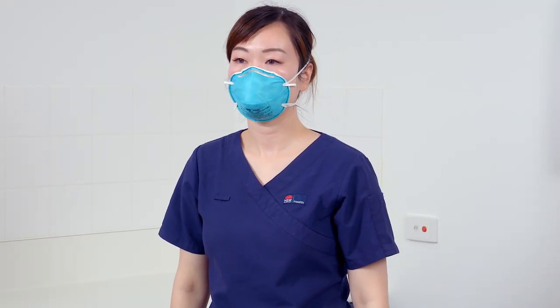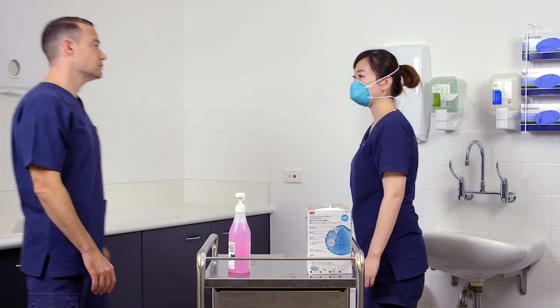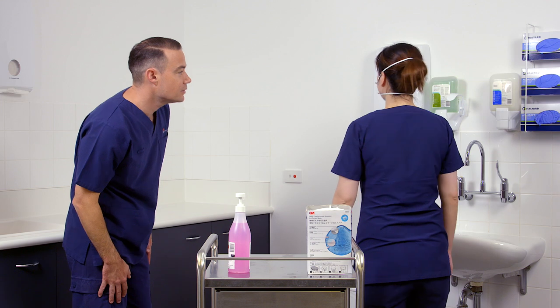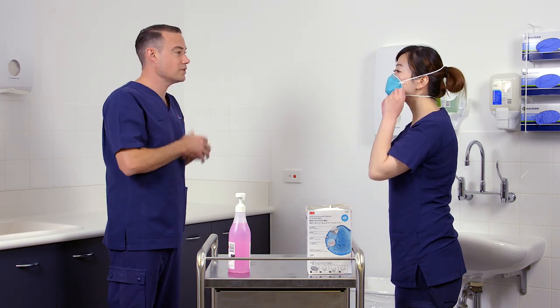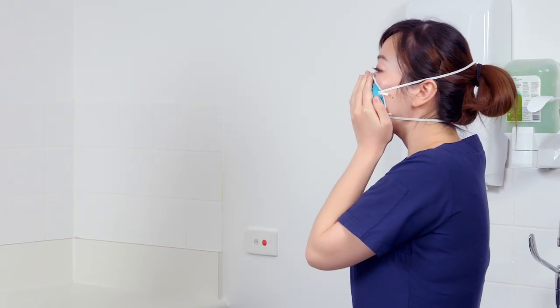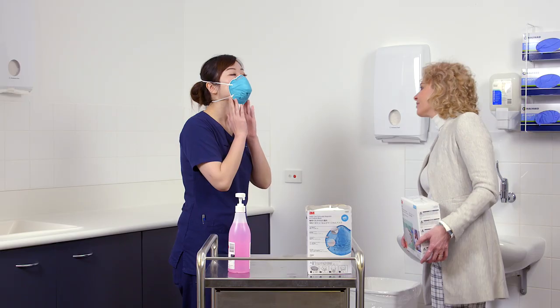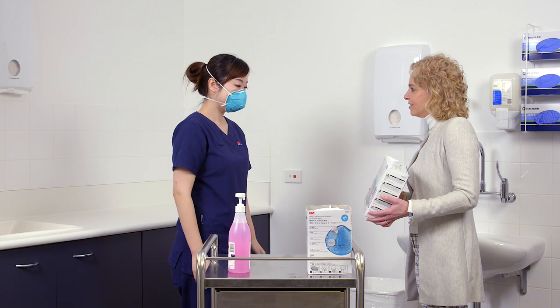If you can't achieve a seal, ask a colleague if available to check that the straps are not twisted, or for hair or earrings that might be caught in the seal. After making adjustments, repeat the fit check. If you cannot achieve a proper seal, do not proceed with your clinical activity. See your supervisor for advice. You may need to try a different respirator.